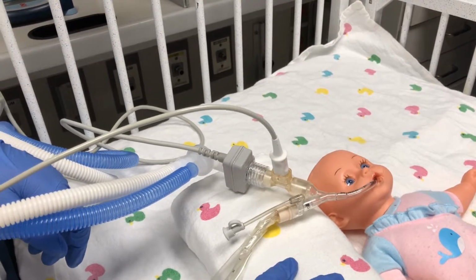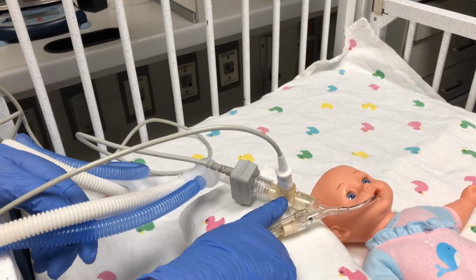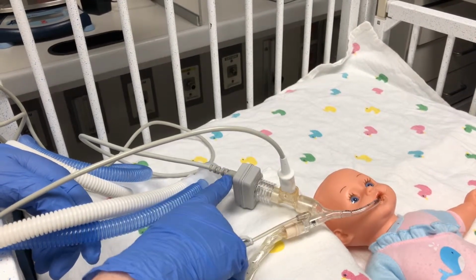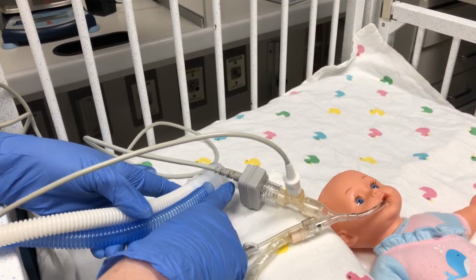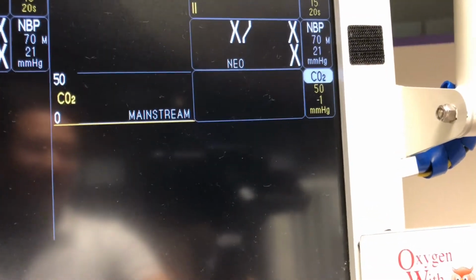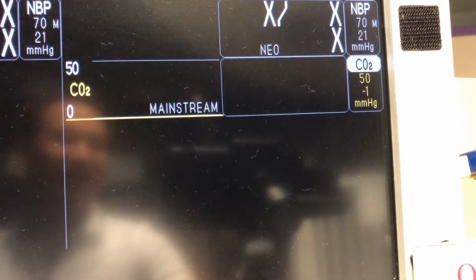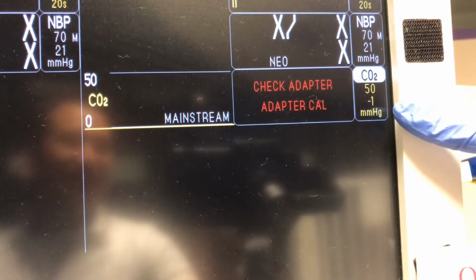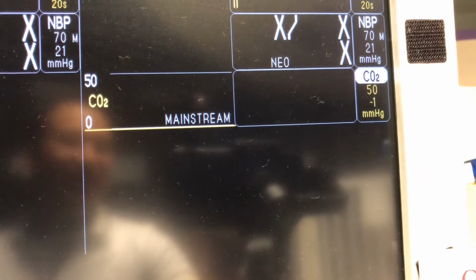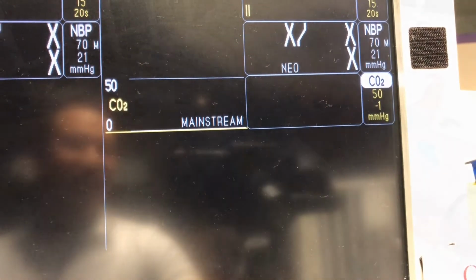And be sure to order. Again, you're going to have your ET tube, your flow sensor, then your CO2 adapter, and then your vent tubing. So one thing you may have to do is troubleshoot your adapter. The first thing that'll happen, and this will be what either you or the nurse notices, is up here, instead of having a reading, you're going to have a message that says check adapter, adapter calibration.